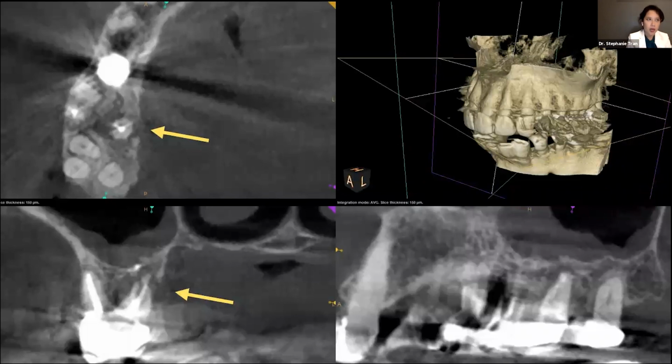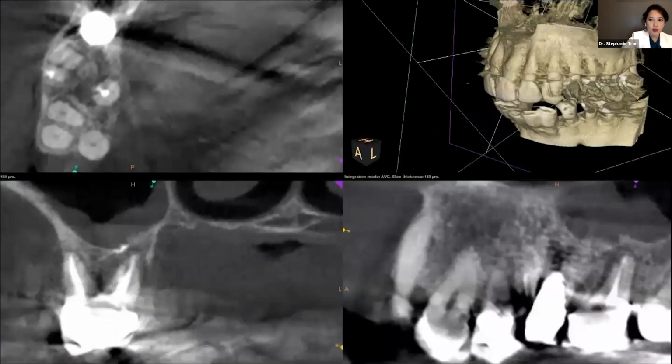So it's the patient's biting pain and the signs and symptoms, and the deep probing, and that deep probing combined with the bone loss on both sides, and the bone loss in multiple areas across this tooth. So we can see here, that's where I was looking for that fracture. And we can see that from multiple angles. Those multiple angles, the multiple areas of bone loss and that deep probing and the patient symptoms all helped me confirm that it was consistent with a vertical root fracture.